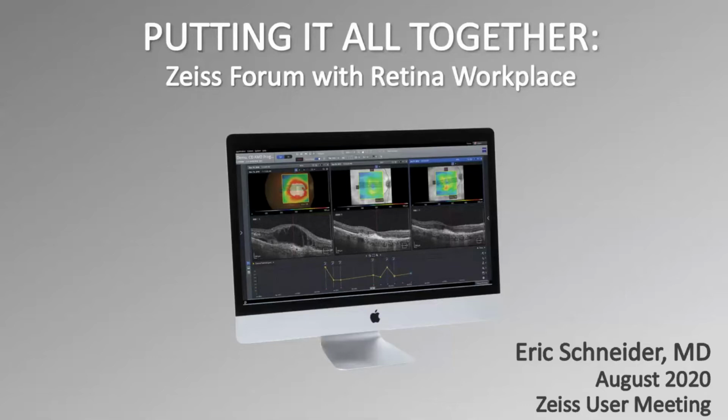All right, why don't we launch into the meat of our presentation here on Zeiss Forum Review in Retina Workplace. The presentation is entitled Putting It All Together because hopefully, as you'll be able to see during the course of the talk, this is exactly what a high quality image review platform can do for your practice, at least in terms of retinal imaging.